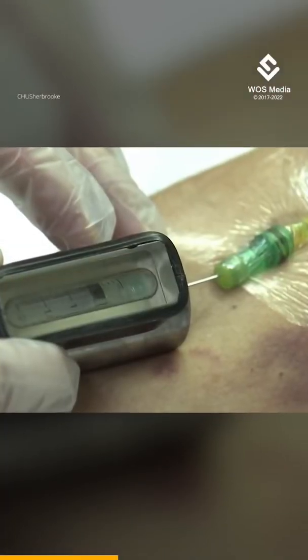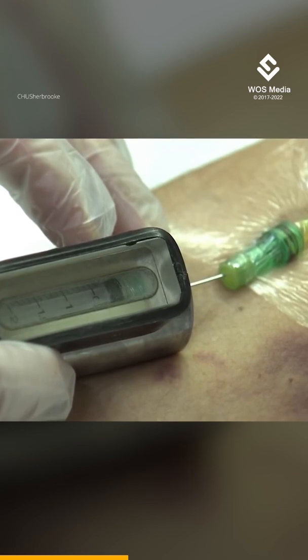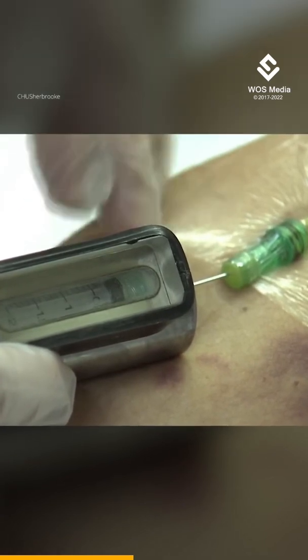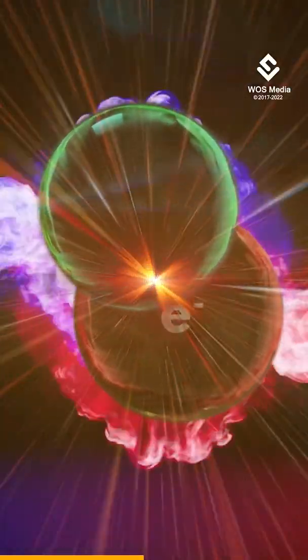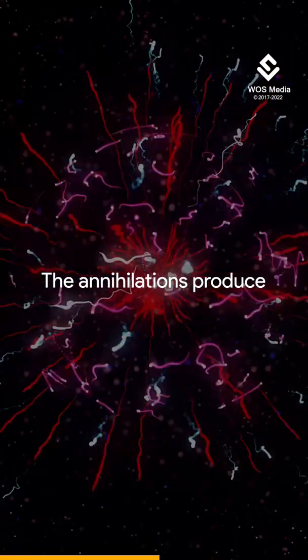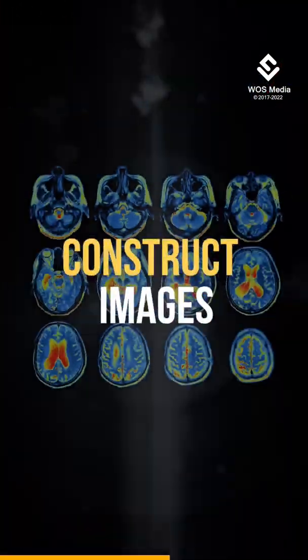These are injected into the bloodstream where they are naturally broken down, releasing positrons that meet electrons in the body and annihilate. The annihilations produce gamma rays that are used to construct images.